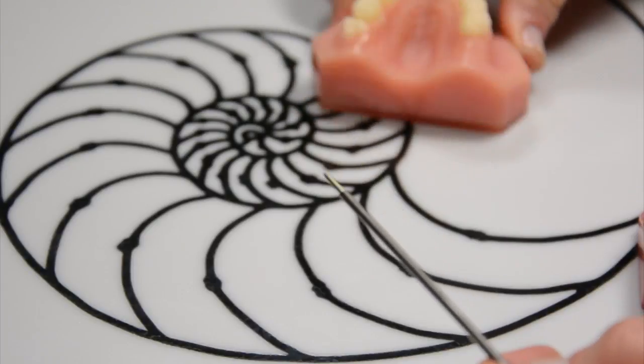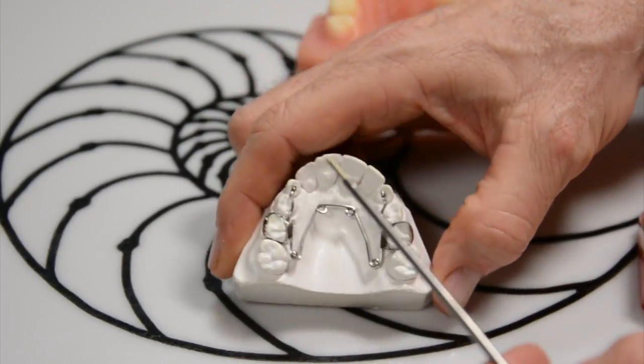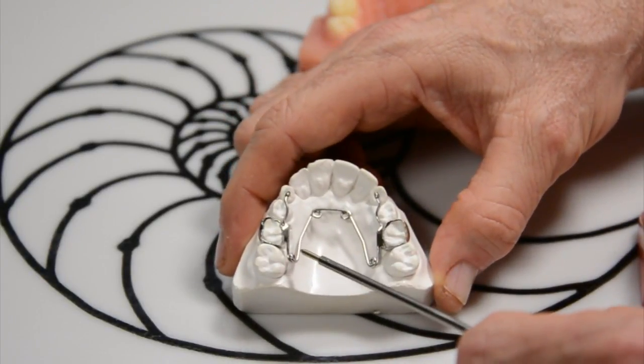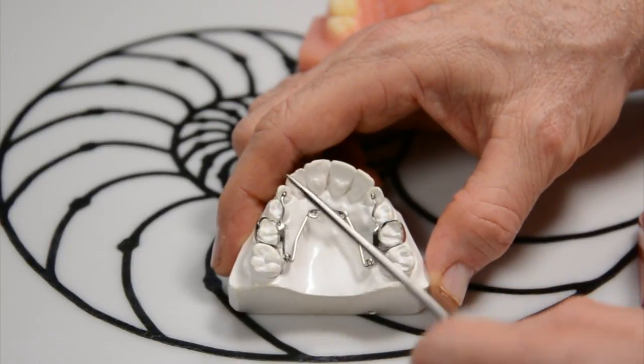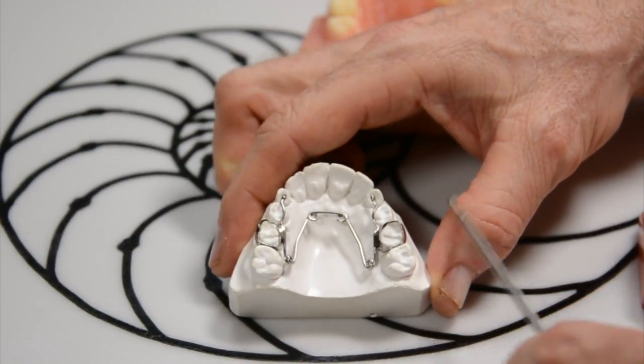What we normally use is this device right here called a quad helix. Quad meaning four — one, two, three, four. And helix is a little curl there, like a curly fry. We use this to expand the upper jaw.